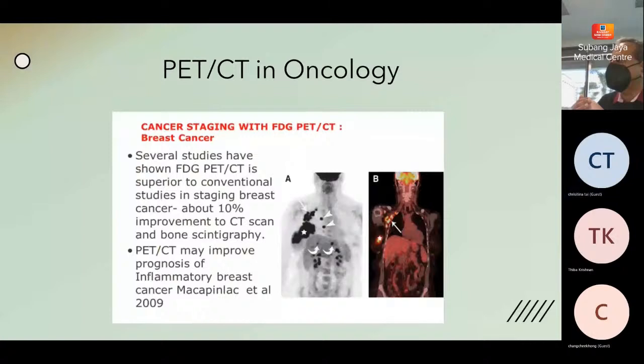I think a couple of years ago, in a non-Hodgkin's case, Dr. Ng's case, on the PET scan we kept seeing this sclerotic lesion there, which is not picking up on an FDG. On the breast, there's normal physiological uptake, nothing really intense. And what happened? The sclerotic lesion was getting hotter and hotter, and we're not sure what's going on there. Subsequently, we did a bone scan, and it was lighting up very hot in the bone scan. And a mammogram shows that she had a small breast cancer. This is met.